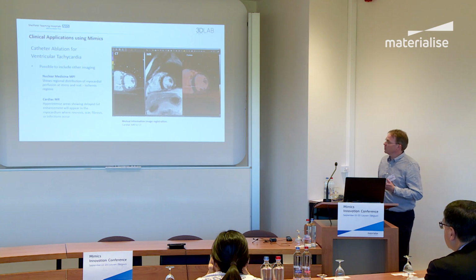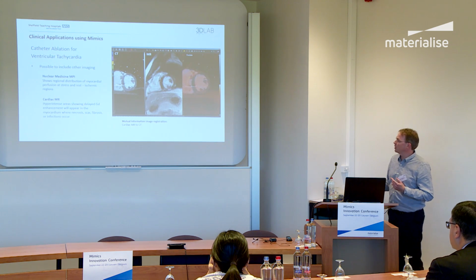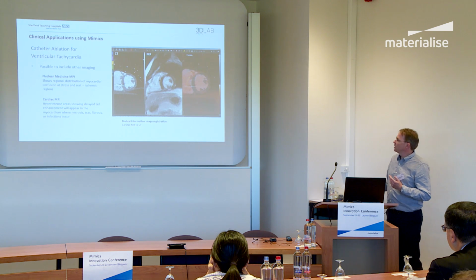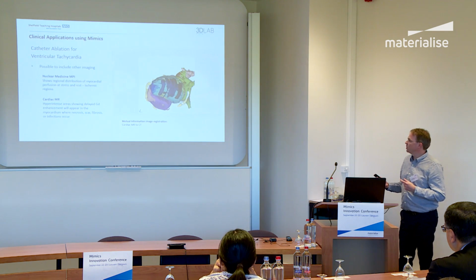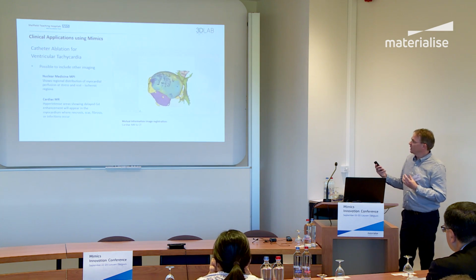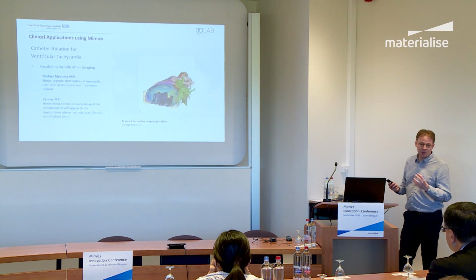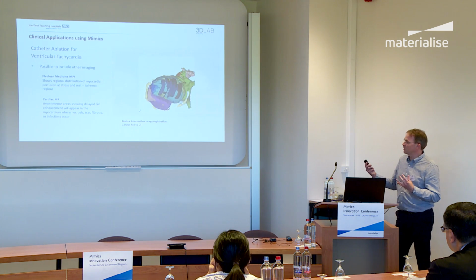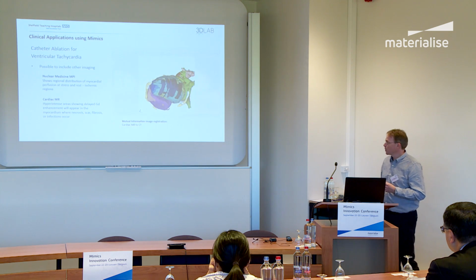We've done a similar thing with cardiac CT and cardiac MR, where we've fused the CT and the MR together, and we've identified regions from the delayed gadolinium enhancement scan. And from that, again, we produce another model where we add in the scar tissue. It looks a bit blocky on here because the MR scan is quite thick slices. But nevertheless, that information is really, really useful for the cardiologist.